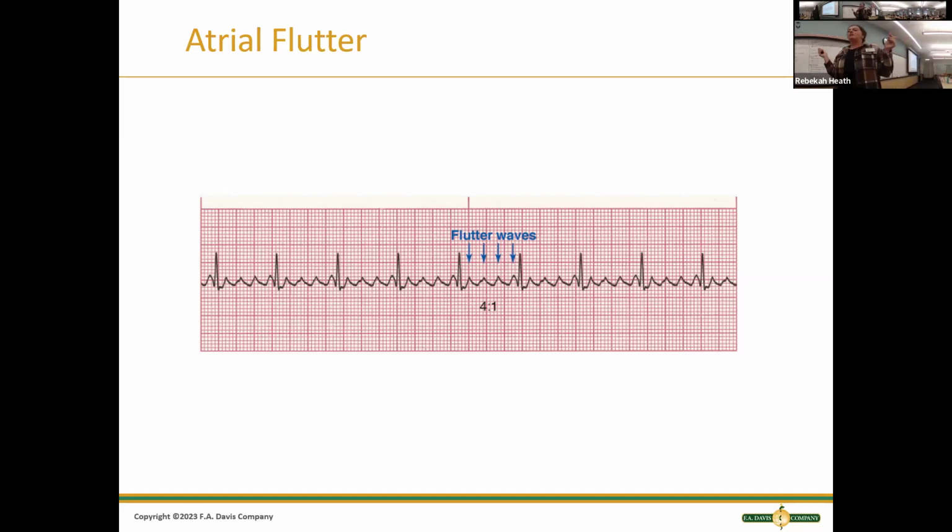All right, let's go. Just because we had so much fun measuring this, let's measure our atrial fibrillation, that rhythm that's right below. Measure from the first 2 QRS complexes and see if those measure out regularly. They don't. Because you can kind of look at it and tell, right? So we can tell that that next strip is irregular.